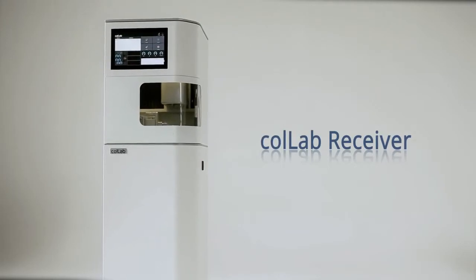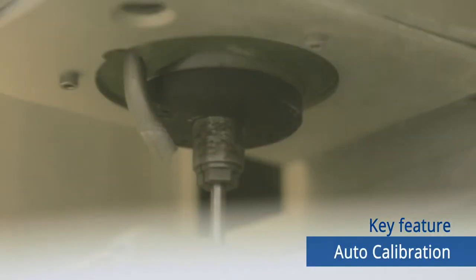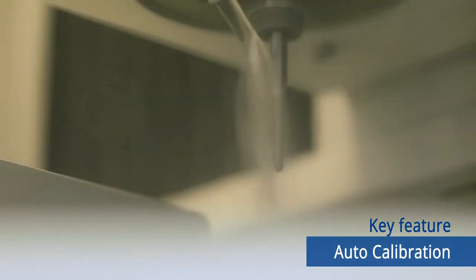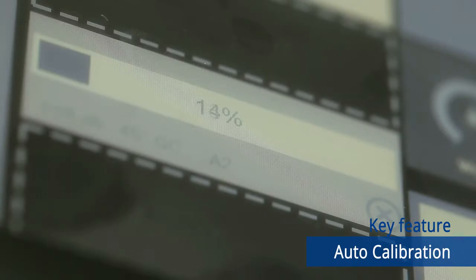CoLab Receiver auto calibration function makes it possible for users to easily calibrate the CoLab Receiver on their own. In this way, any distortions that may have been found from axes are automatically calibrated ensuring high quality final restorations.